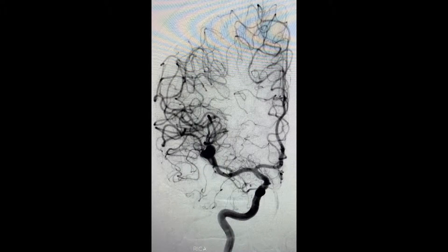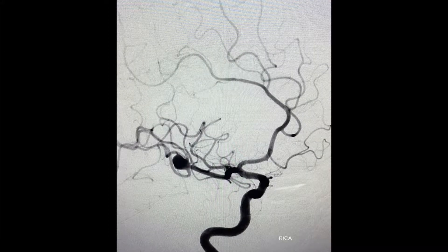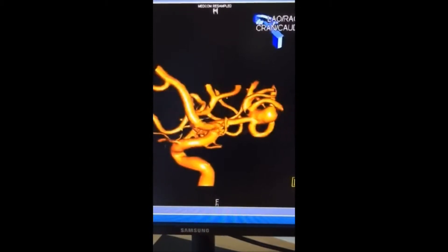This video illustrates evaluation and treatment of a large, complex middle cerebral artery aneurysm. The AP and lateral views show a complex shape with three or greater branches coming out of the base of the aneurysm distally located. The 3D reconstruction helps to clarify this, and then a 3D spin angiogram was obtained which helps to further clarify the relationship between the proximal distal arteries and aneurysm base and neck.